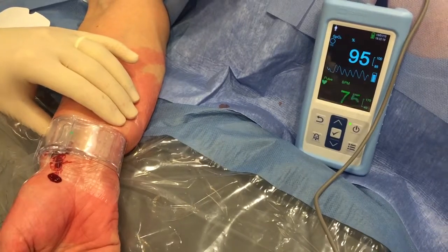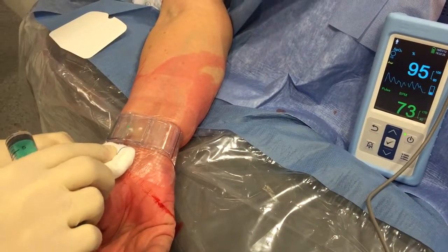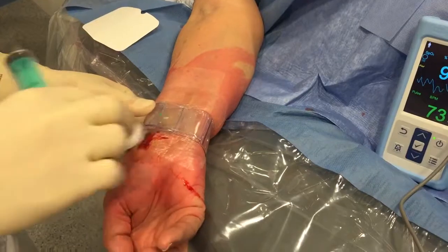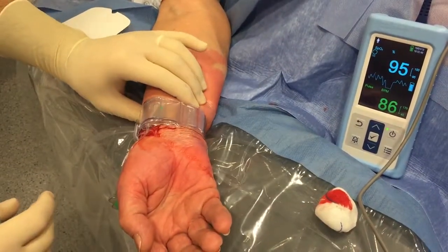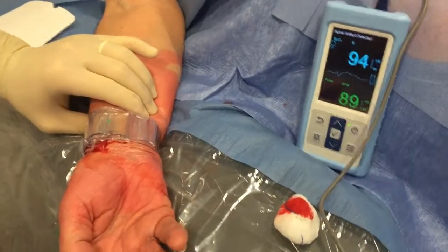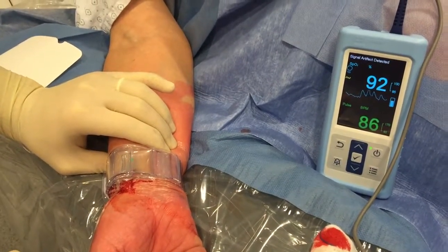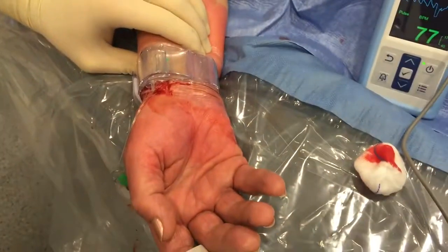We try to compress the ulnar artery again. We have bleeding, so we have to put back one cc of air because of the bleeding. This is the balance between the bleeding at the level of the artery and achieving a patent hemostasis, which is not always possible. After re-adding one cc of air, we have a curve on the plethysmograph — we have achieved patent hemostasis, meaning we have a non-occlusive compression of the radial artery with no active bleeding at the puncture site.